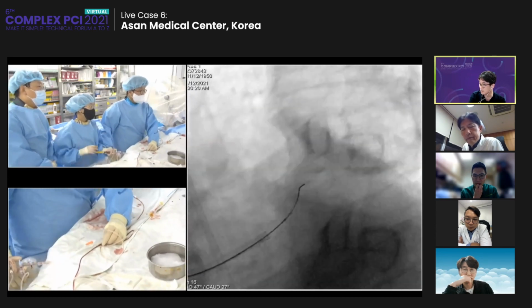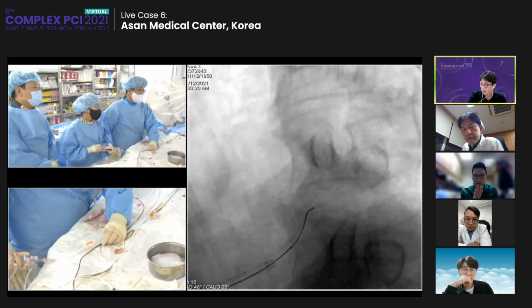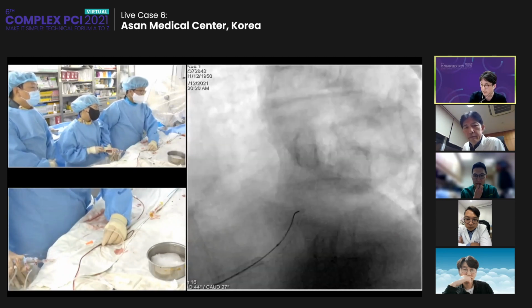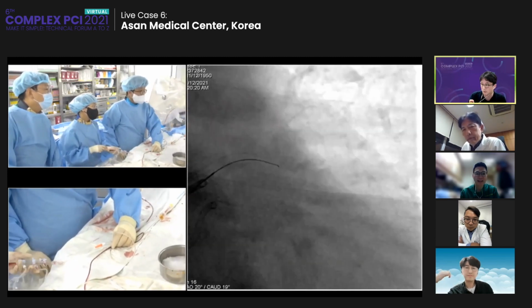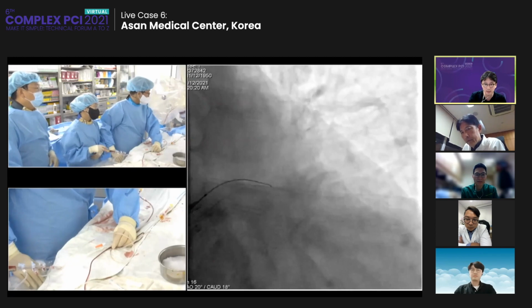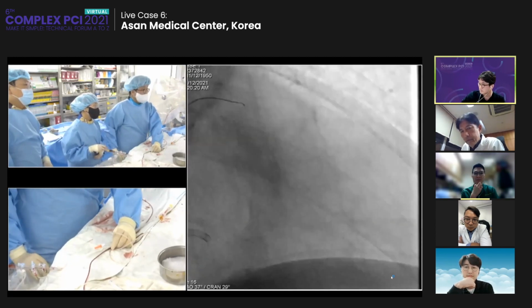There may be a microchannel there, but I selected this wire because you mentioned that the previous session had some wire in another space, and we never know. So I just wanted to control my wire in the exact position that I wanted. Quite good in this position. I like it. Now I would like to advance.